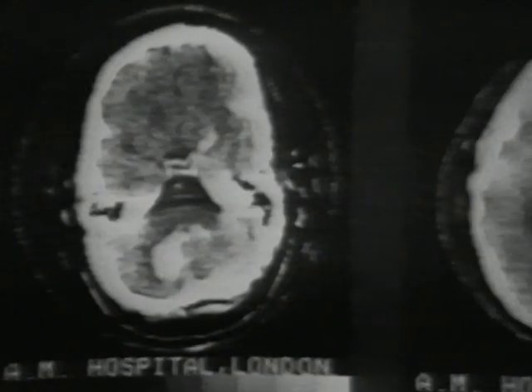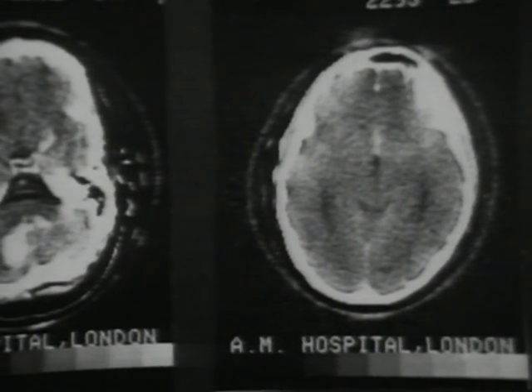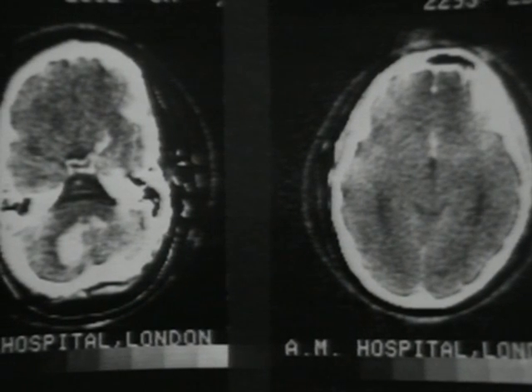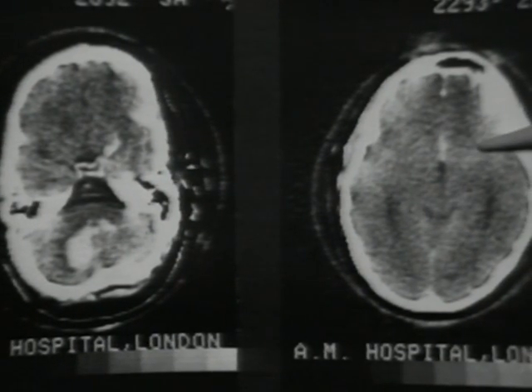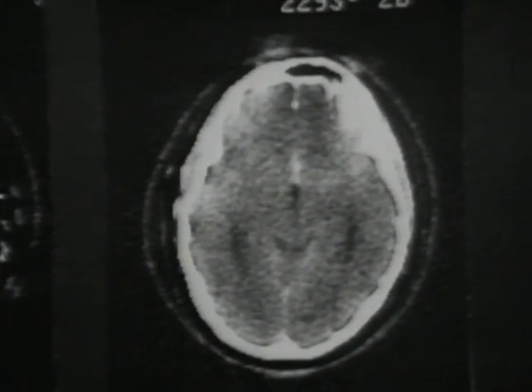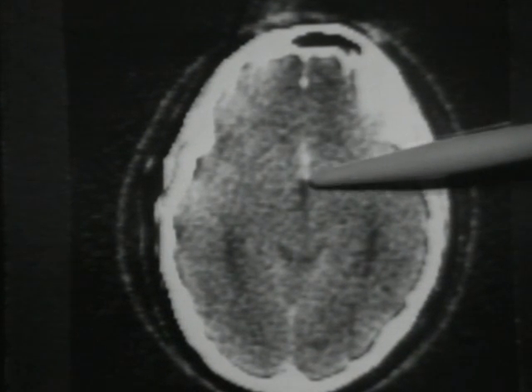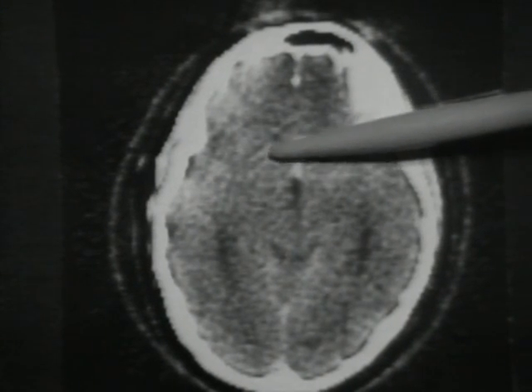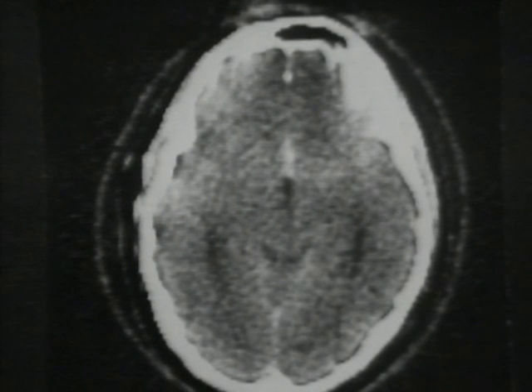In other cases of hemorrhage, a ruptured aneurysm may be responsible. And if we have multiple aneurysms, it may be difficult or impossible, using the means ordinarily at our disposal, to distinguish which aneurysm has in fact ruptured. This is where the EMI scan plays another important role. We can detect the small local hematoma, and this is just such a case. This was a patient with multiple aneurysms, including an anterior communicating artery aneurysm. Here is the hematoma lying immediately in front of the third ventricle, indicating that the anterior communicating artery aneurysm had in fact ruptured.